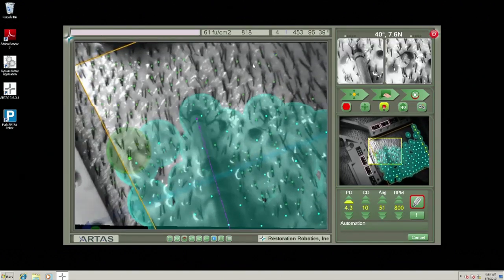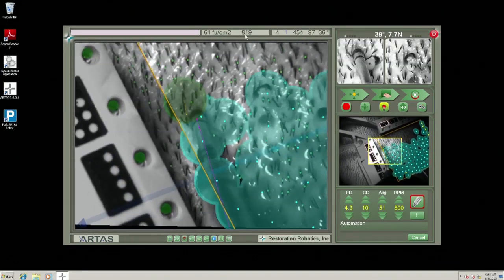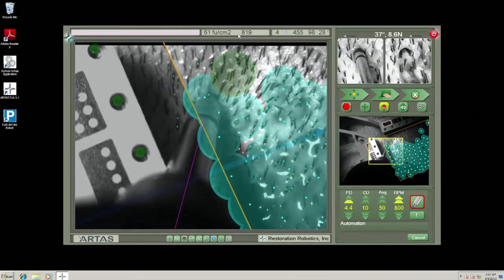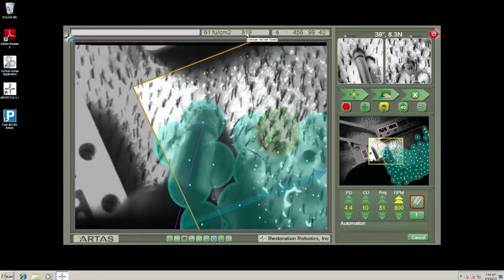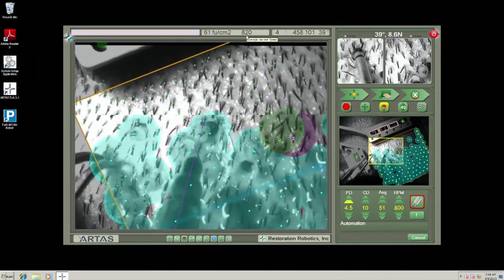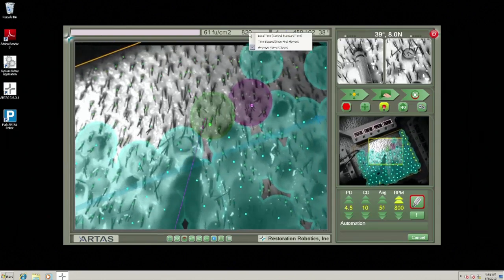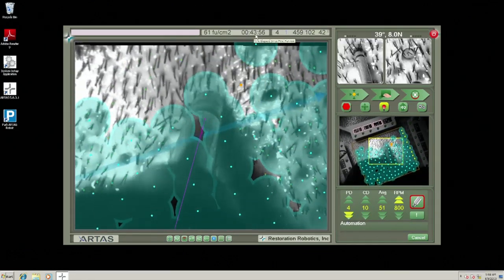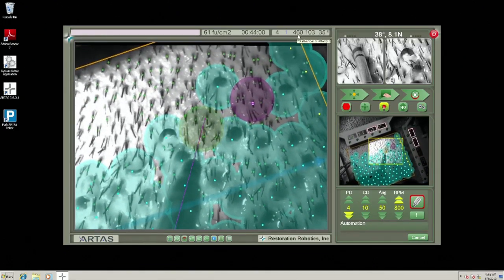Average harvest speed. So far, our harvest speed, which is the speed of the needle going from graft site to graft site, and this will modify every so many harvest attempts, but we're looking at about 820, just over 800 grafts or harvest attempts per hour. When you look at the elapsed time, we're at 43 minutes and we've performed 460 harvest attempts thus far.